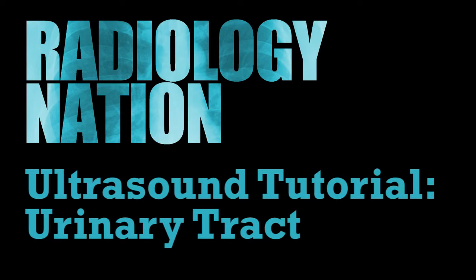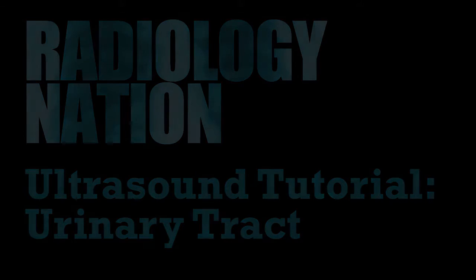Welcome to this ultrasound tutorial on the urinary tract. We will demonstrate a technique for imaging the kidneys and the bladder, stopping along the way to point out the relevant anatomy and provide useful technical tips.